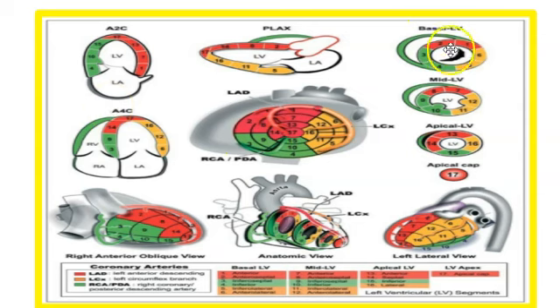It looks like a fairly complicated picture here, but it has all of our angle views in there, and it also has this bullseye view to show the whole left ventricle primarily, and where the ventricular segments are, how they're broken down, and what coronary arteries perfuse those particular segments. And you can see those are colored in green and so on. I know this isn't the easiest slide to see, but we're going to break this down for you, so don't be too concerned about that.